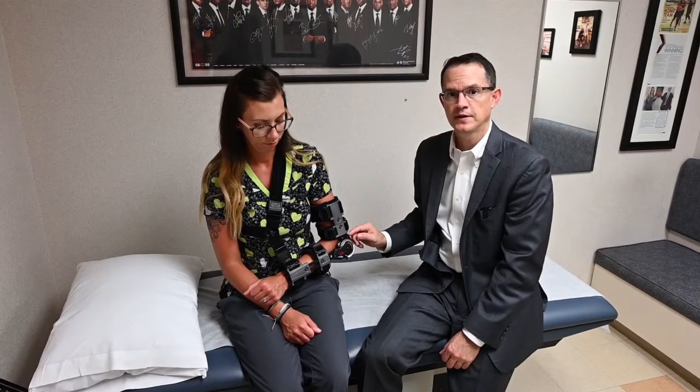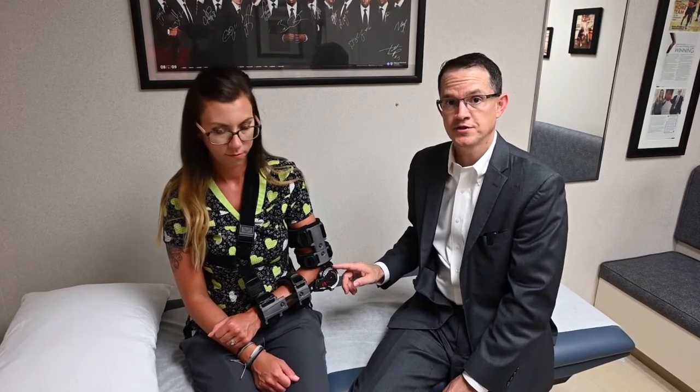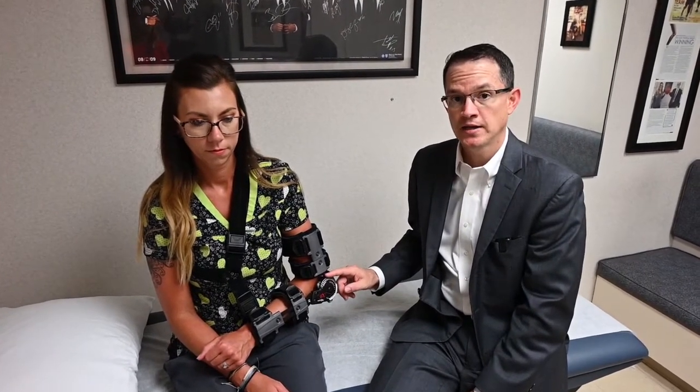As we had previously discussed, how much range of motion we give you and how aggressive we are with your post-operative rehabilitation is largely dependent on the amount of tension that is on the biceps repair. For the initial week following the operation, the elbow is kept locked at 90 degrees of flexion in order to allow the initial pain and swelling from the operation to improve.